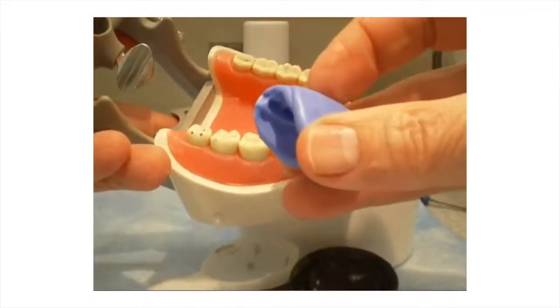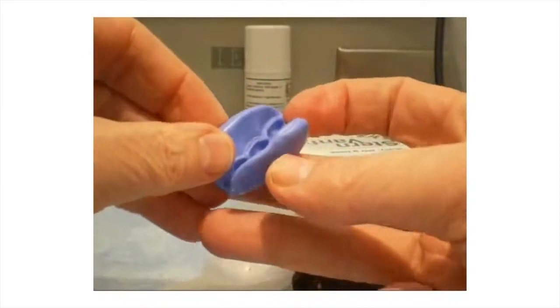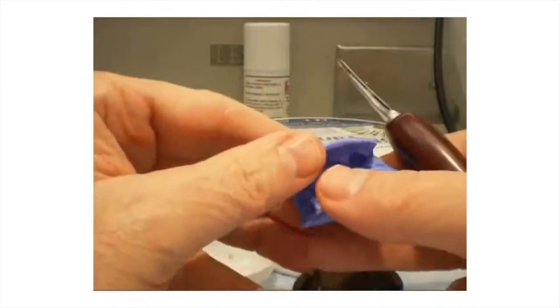The reduction guide may be segmented as seen in the diagram. The matrix should engage enough of the base of the model that it will remain stable after the tooth has been prepared.